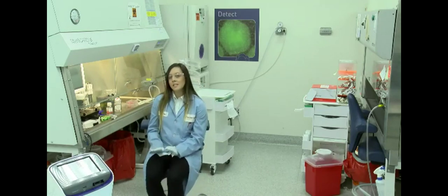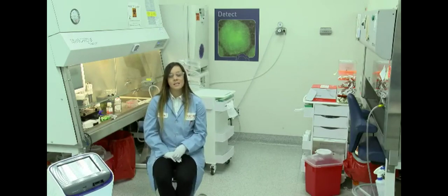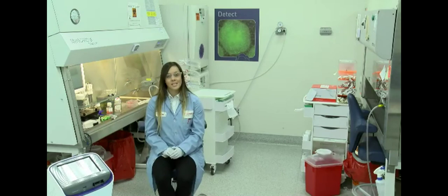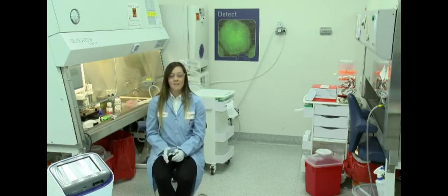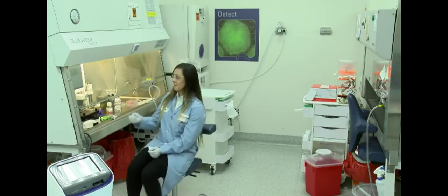However, for the purposes today, we actually recommend that if you want to use the B27 Plus media system, you start out culturing in B27 for about 3 to 7 days and then transfer over to our B27 Plus media system. So we're going to do that today for you guys.